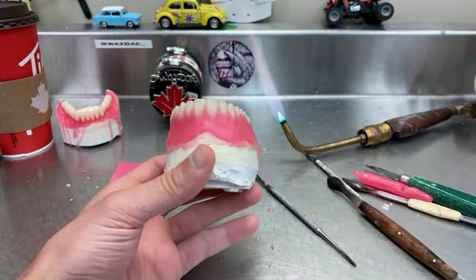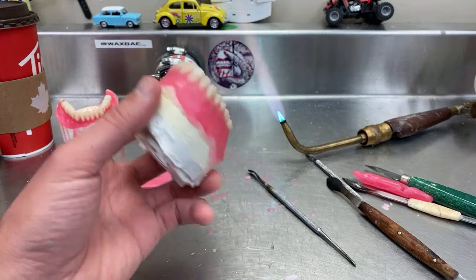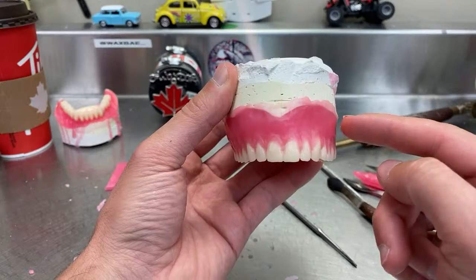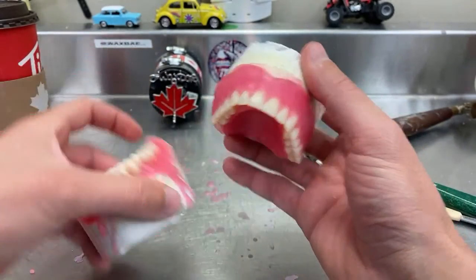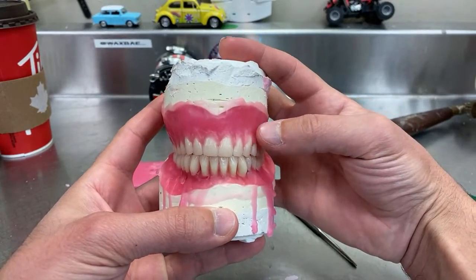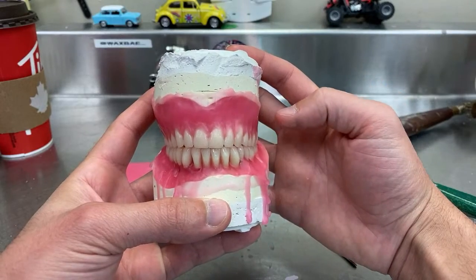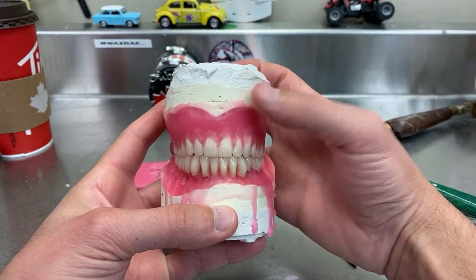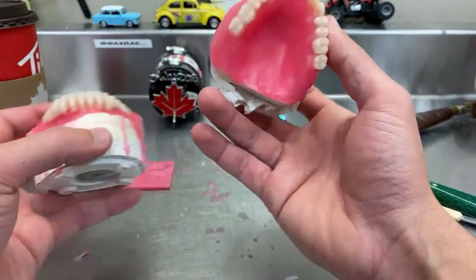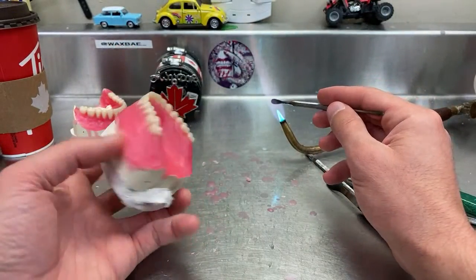And then, let me see what this guy's saying here. You have a bulky gingiva at the right side. Yes, good eye. This is actually because of the jaw. That patient actually has a lopsided kind of bite. So they bite, the ridge is actually sticking out more this way. That's why I said the teeth out, because it has to be on the top of the ridge. If I set them like this, I will be off the ridge because the ridge is really close here. I'll try to take it off the model and then I'll show you. Good eye.